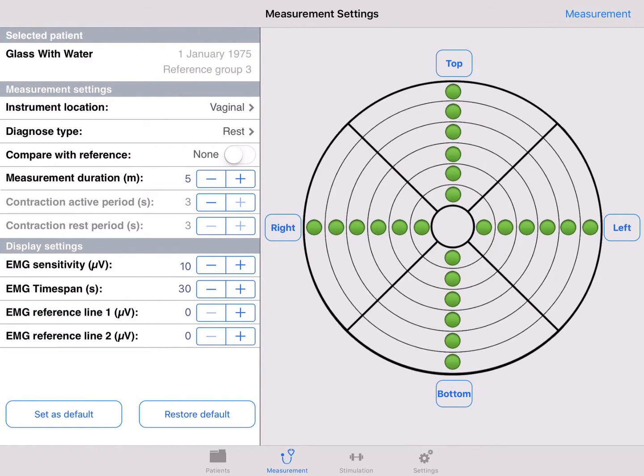I'll show you an MVC measurement compared to the healthy reference group. In the measurement settings screen, select diagnose type MVC. Select compare to reference group. Press measurement on the top right.